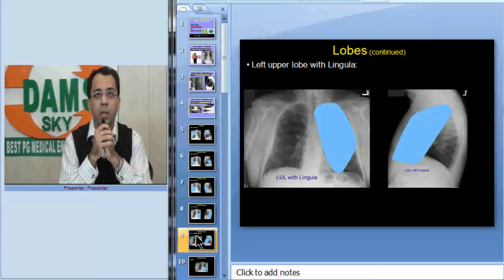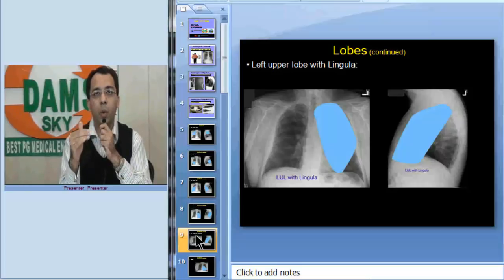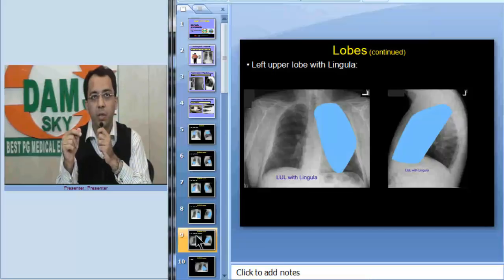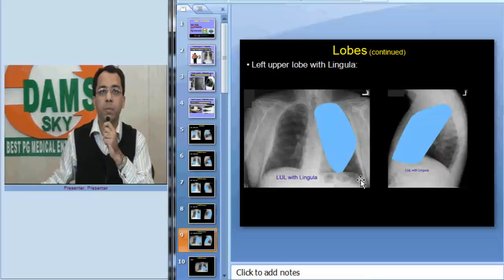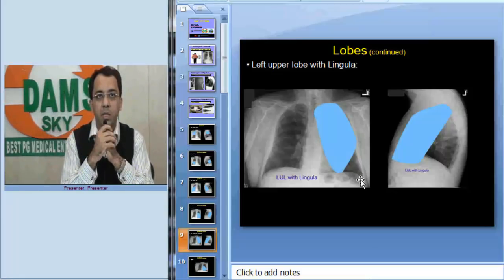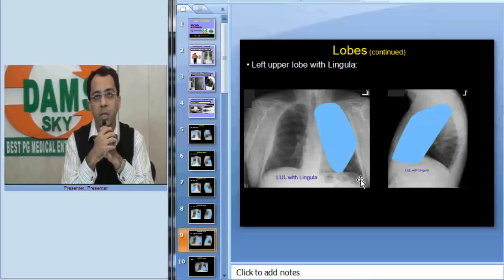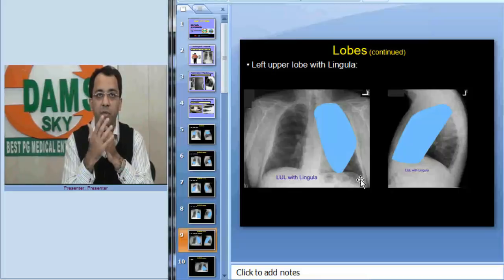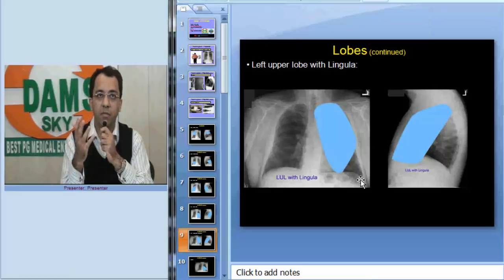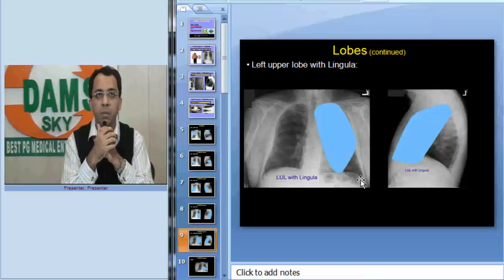Now let us look at the left upper lobe. The left upper lobe is larger than the right because the lingula is part of it — it is divided into an upper division and a lingular division. Sometimes a left upper lobe collapse is difficult to identify because the superior segment of the lower lobe over-inflates and interposes between the aortic shadow and the collapsed upper lobe, making it look hyperlucent. This has been called the luft sichel sign — luft means air, sichel means sickle.